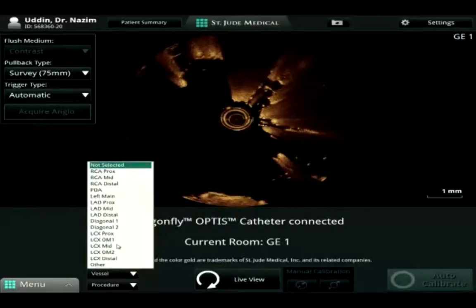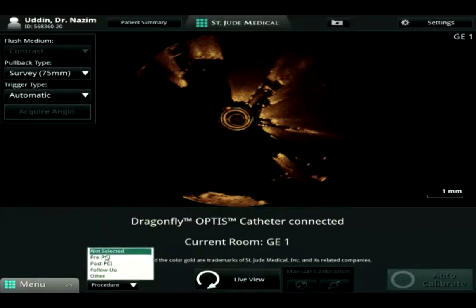So now we're going to give a bit of nitro and we're going to take the final angio shot. Your OCT is working now? Okay, now Murshid is very keen to take a single OCT shot. So our OCT machine apparently is working now, but it is not giving angio co-registration. So even if it's not giving angio co-registration, when we take the final shot for our angio, we'll just take a shot with the OCT. So no extra dye will be used. So at least we can get a bit of OCT, right? And as this is our final shot and the procedure is almost finished, we're taking our OCT now.